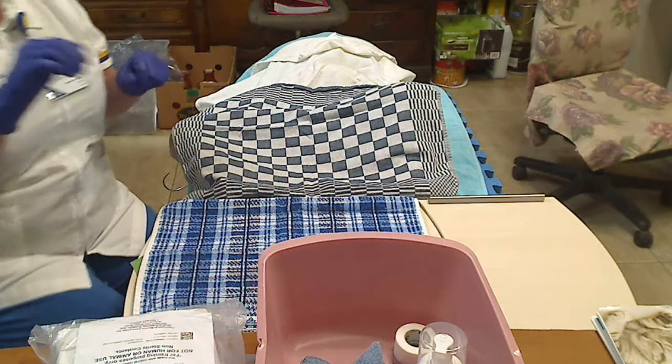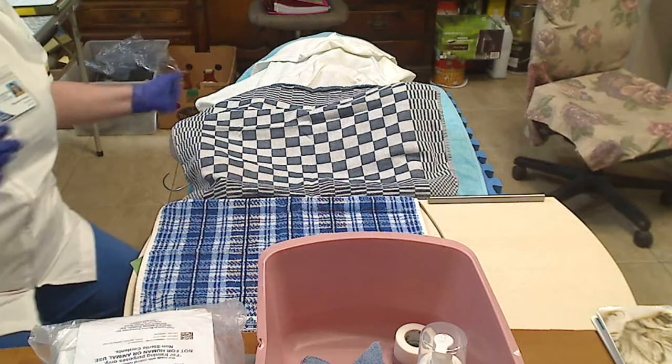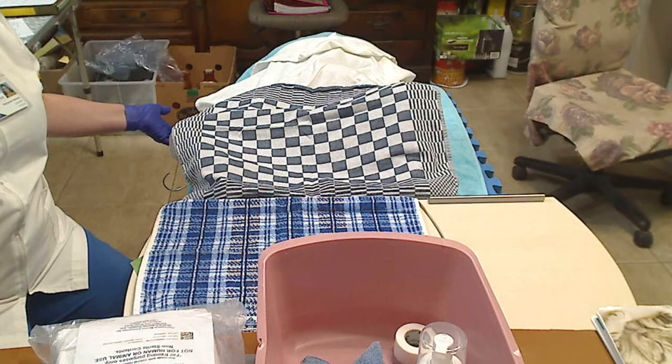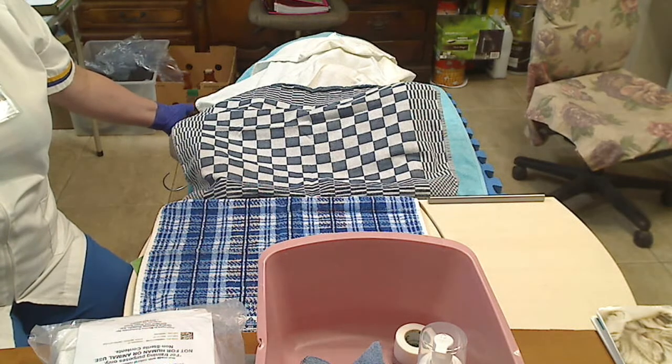So the first thing I need to do is to make sure that Anna is at the right height. So I'm going to go ahead and raise her bed so that it does not hurt my back while I'm doing this procedure.